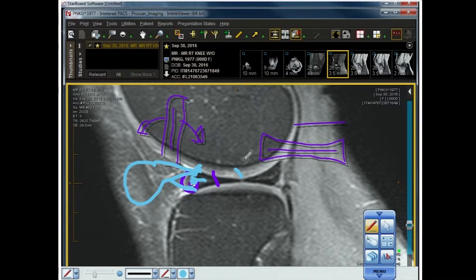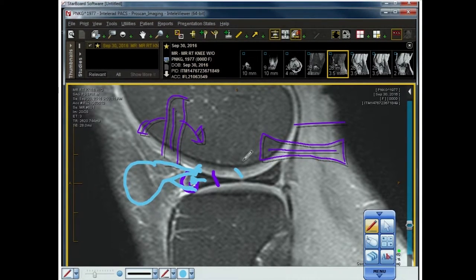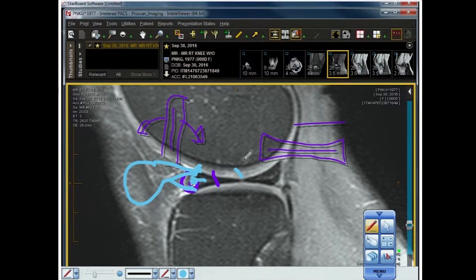Degenerative — if you want to say degenerative, there better be degeneration. There better be DJD, flattening of the femur, deformity of the tibia, chondromalacia. If you have high signal in the outer third of a 12-year-old, it's vascularity — it's not degeneration, as we discussed. Displacement simply means one structure is displaced relative to another. It's a lead-in for other descriptors.